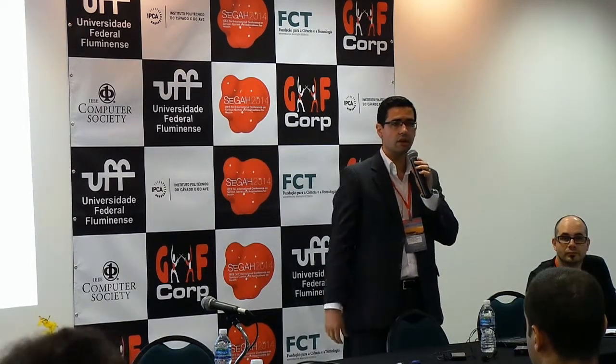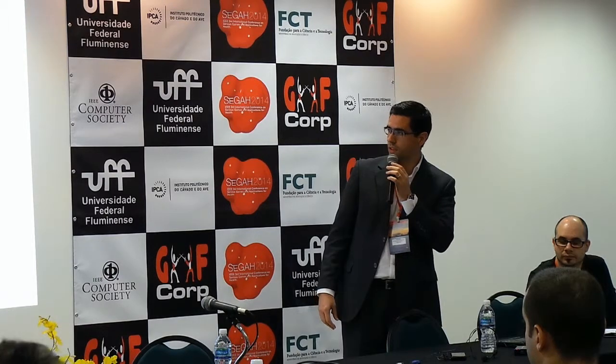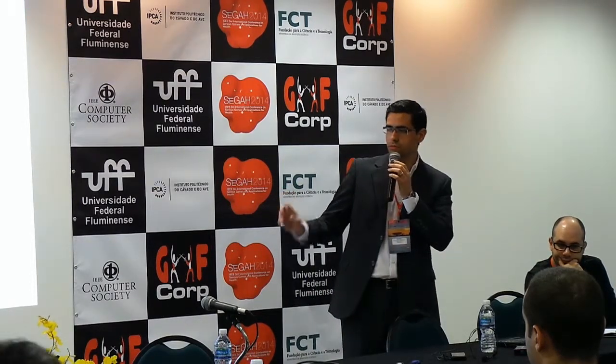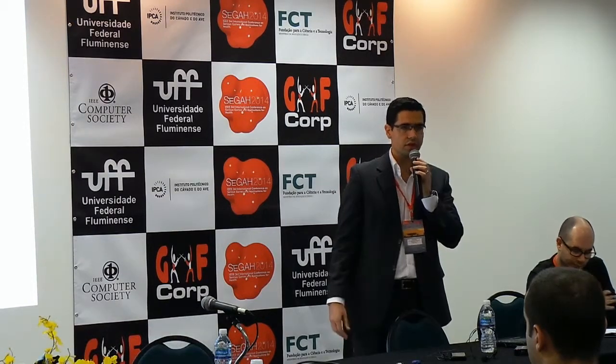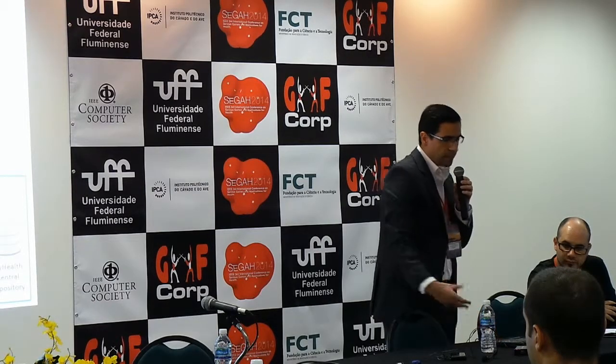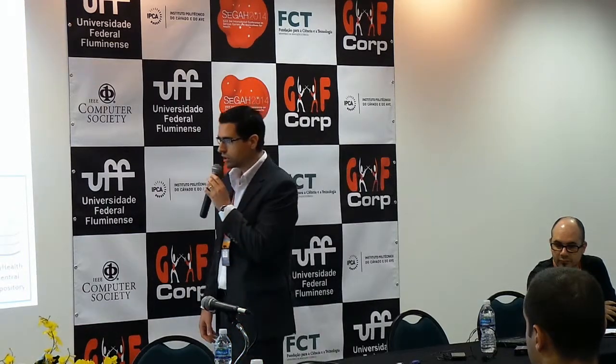So the first, I would say, scenario for this platform is the one where you place this EEG platform on the subject's head, and you can transmit data wirelessly to just a device where you can visualize your data. This is the simpler, the simplistic approach. We are actually pursuing a different approach where you can actually deal with your data in a more complex way and still give more functionality.